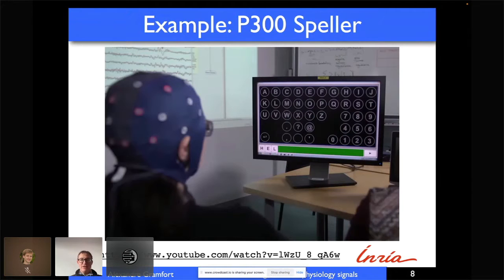All right. Another example of machine learning on EEG is a so-called P3 speller, where you have some letters that are flashed on the screen, and by having the subject focus their attention on one letter and recording the so-called P3 wave, we can find out what letter the subject was actually attending to in order to spell. Here you see letters. So first you have H-E-L, and I guess that could be the word hello.